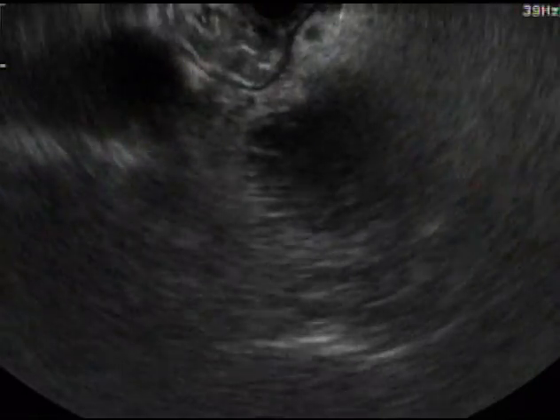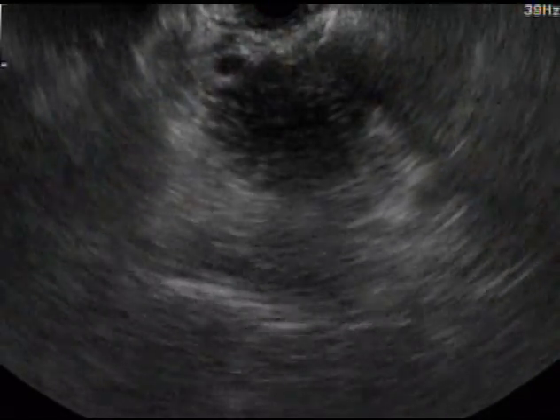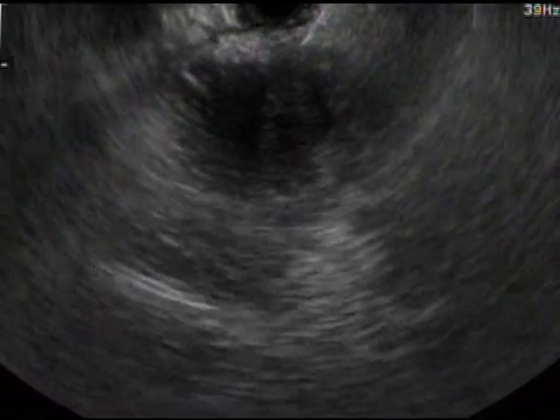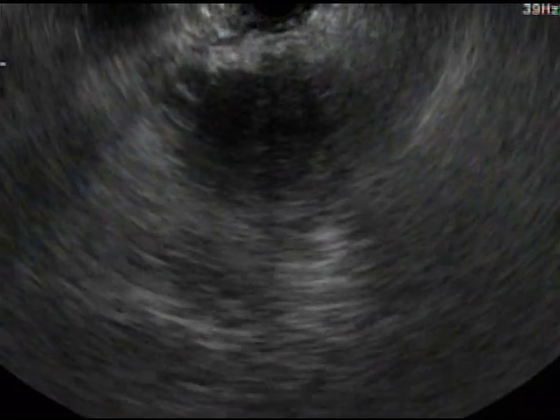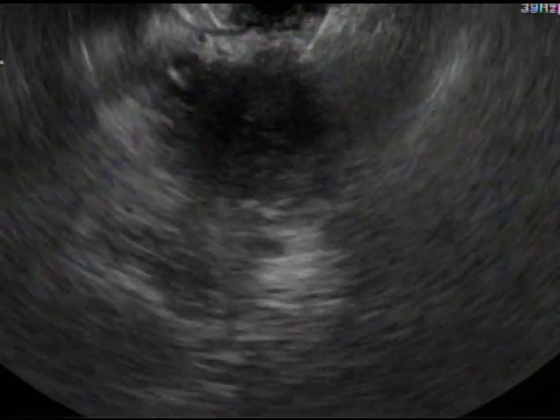Now I'm going to perform an FNA in a different area three times. I'm going to withdraw the needle to the tip of the lesion and use a little bit of tip up to move into a different position. I can also move the scope, torque my shoulder, or use the elevator to get a different angle. In this case, I'm tipped up and using my elevator to move the needle to a different angle. The important thing is the needle should stay within the mass at all times — you cannot move the needle into the duodenal mucosa.